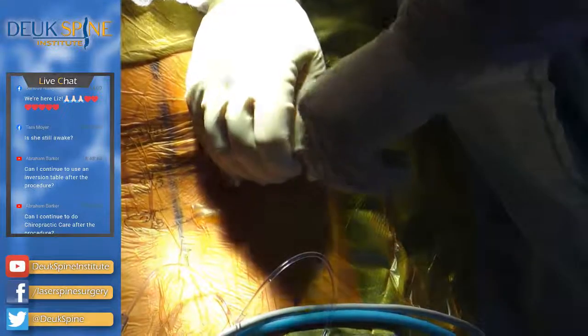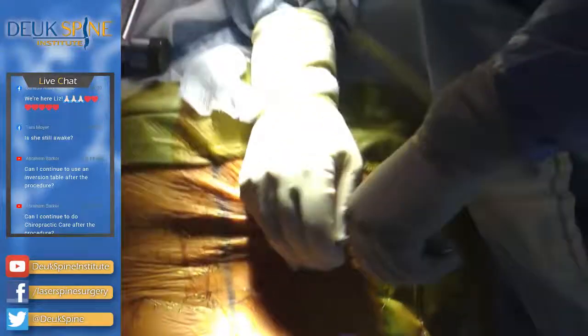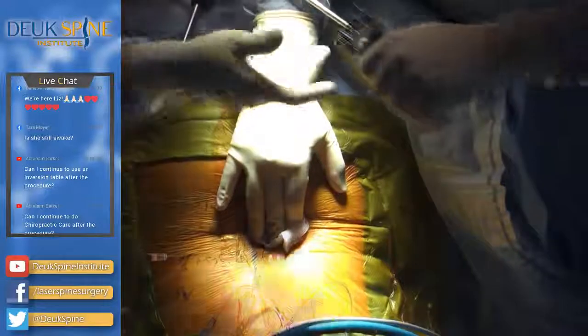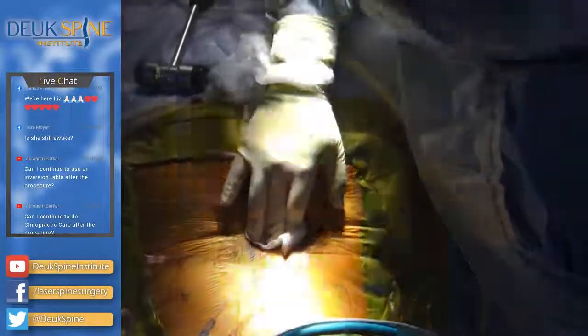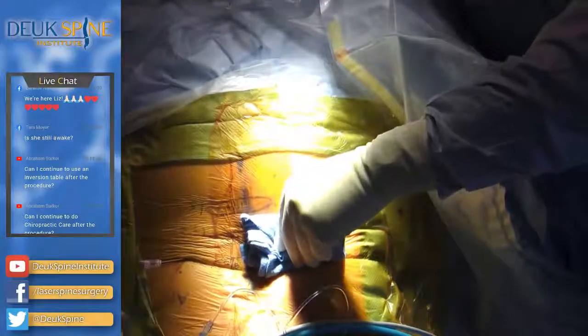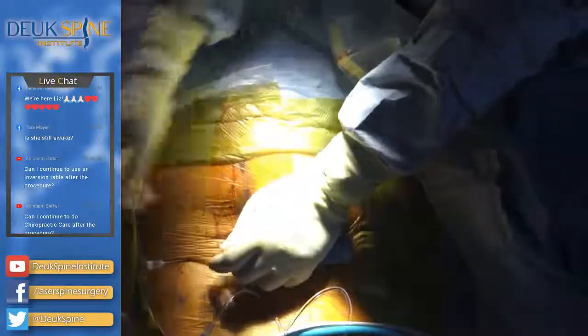Okay. It's going. Not able to get in. Let's do a towel. This one. Yep. All right. Let's do the next one.